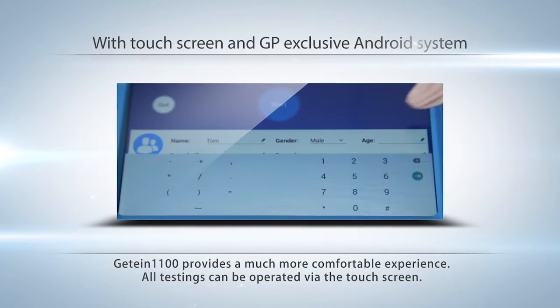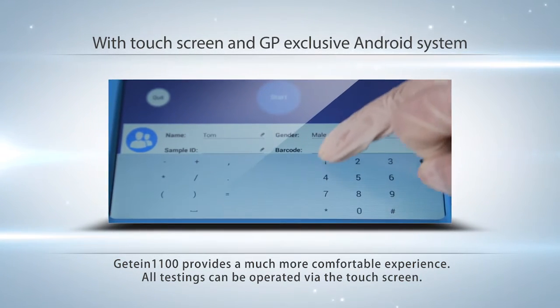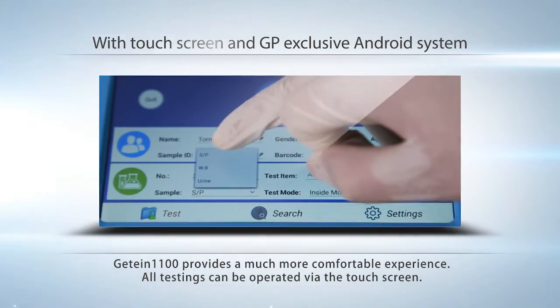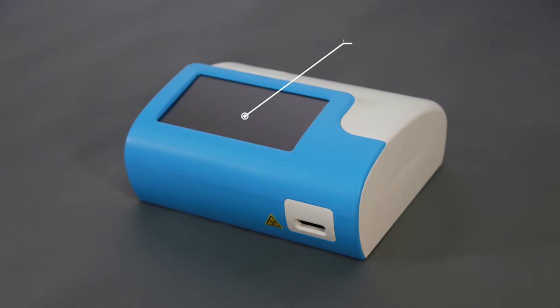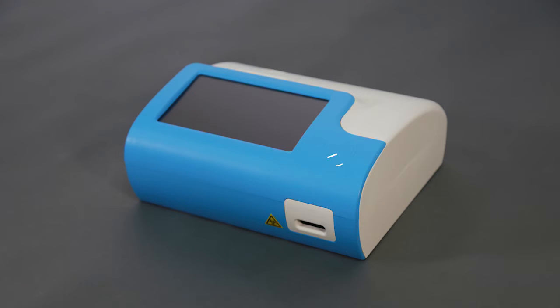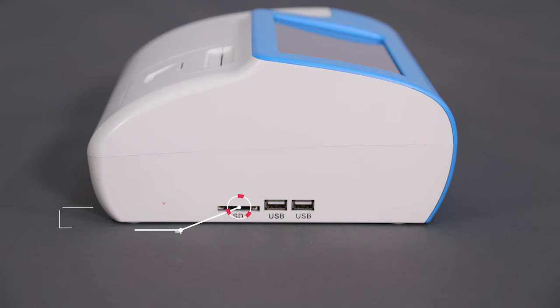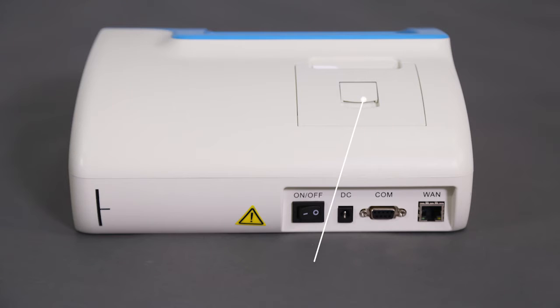With a touchscreen and GP-exclusive Android system, GTIN 1100 provides a much more comfortable experience. All testing can be operated via the touchscreen. On the front of the instrument we can see a 7-inch touchscreen and a RFID area. On the left side is an SD card slot, used to identify parameter information of the product.